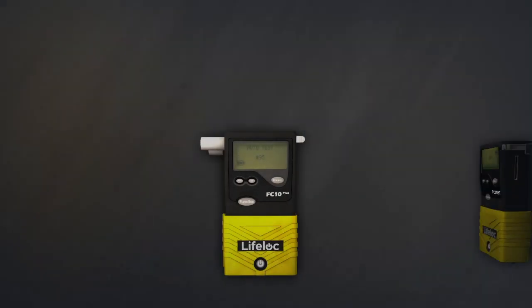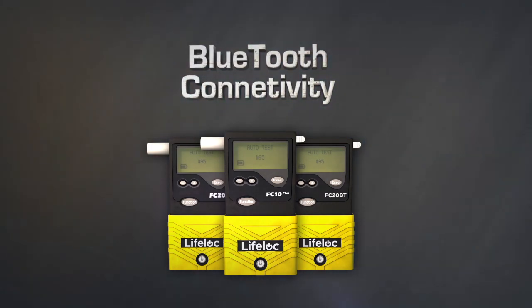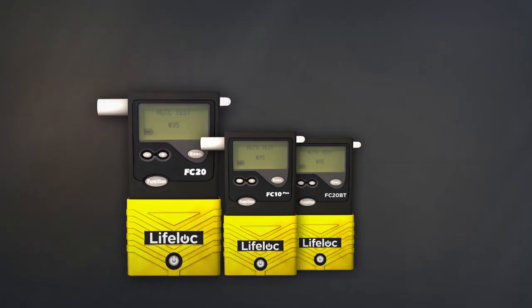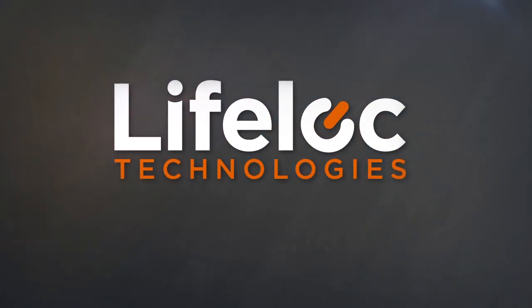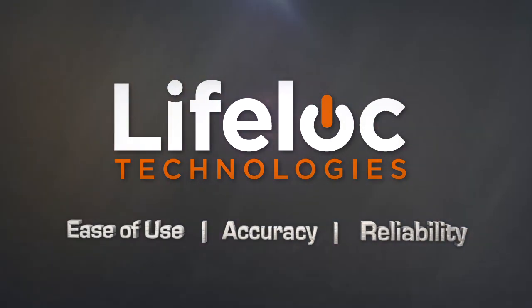For advanced features such as test memory, date and time stamping, result printing, computer interface, or Bluetooth connectivity, check out the FC10 Plus and FC20. There's no better choice for ease of use, accuracy, and reliability in professional breath alcohol testing than LifeLoc.